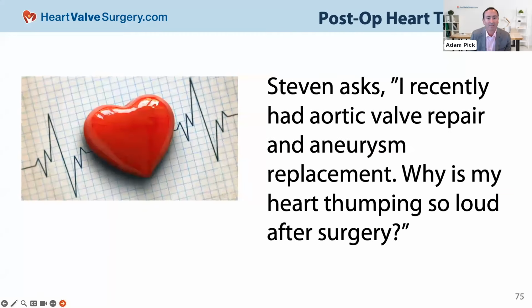Great, thank you. And this is a question from Stephen. I had this experience when I was a patient. He asks, I recently had aortic valve repair and aneurysm replacement. Why is my heart thumping so loud after surgery? So is that immediately after surgery or after a long time? That's the question. And second question I have is that valve repair means, was the valve replaced with a mechanical valve? Because some of the patients do say that they can hear the valve.